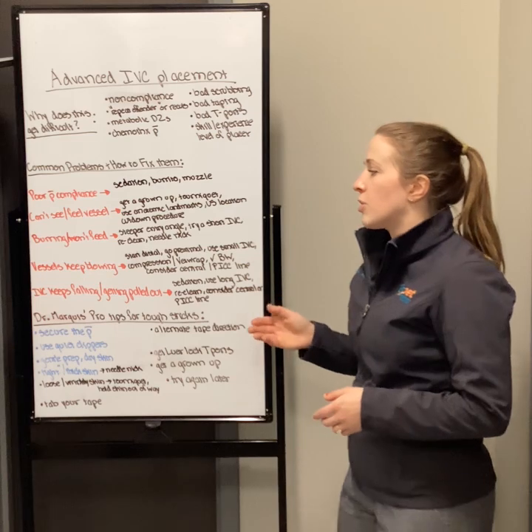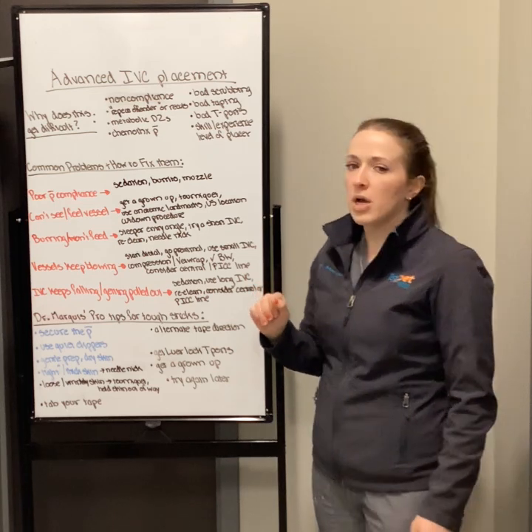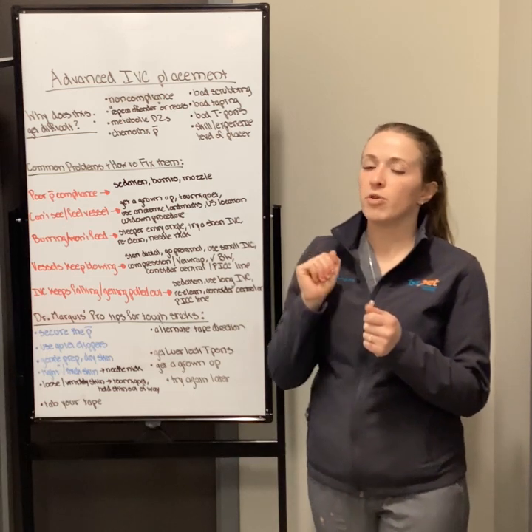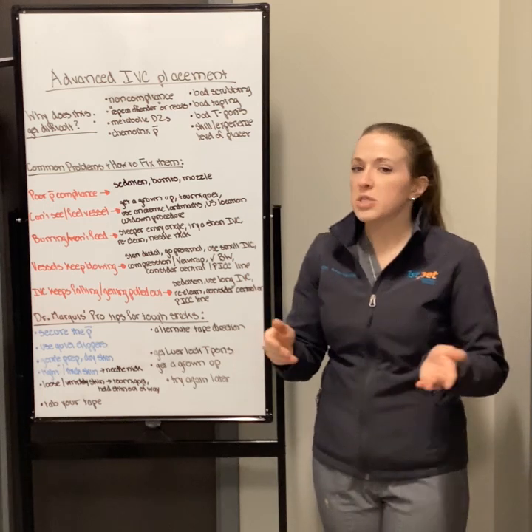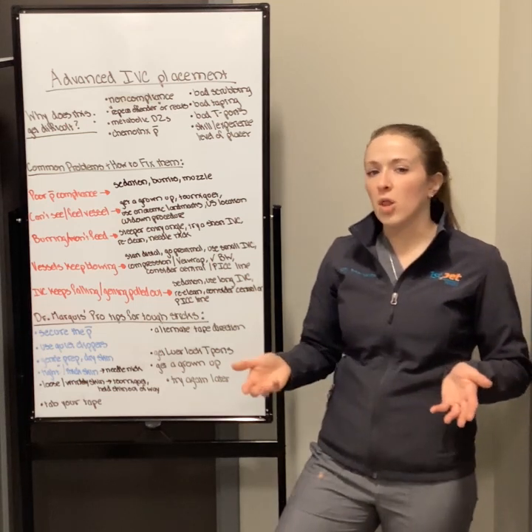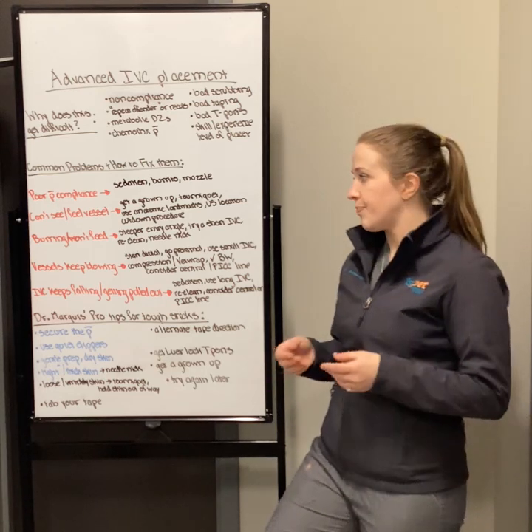A cut down procedure. I talked a little bit earlier about the needle nick, where you take your 20 gauge needle and make a small nick to make your entry easier. But a cut down is a small surgical procedure where the doctor will take a little scalpel blade and cut over where the vessel should be. This way we can pull apart the skin and see the vessel. This is a great option for animals that are very debilitated, where we need an IV catheter fast, but maybe their system is very collapsed, or maybe they've had lots of catheters before. It's a great option if you need a catheter right now.